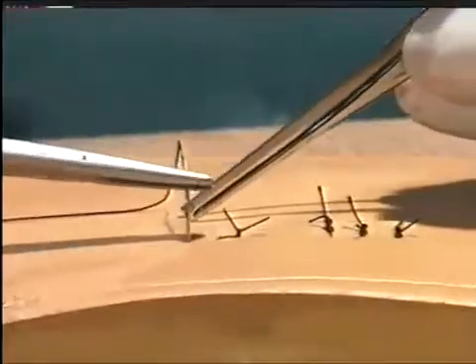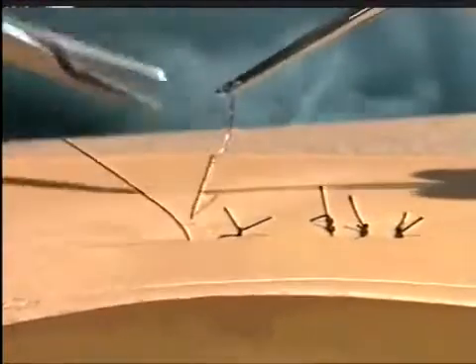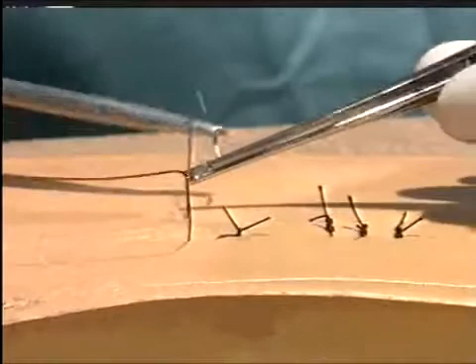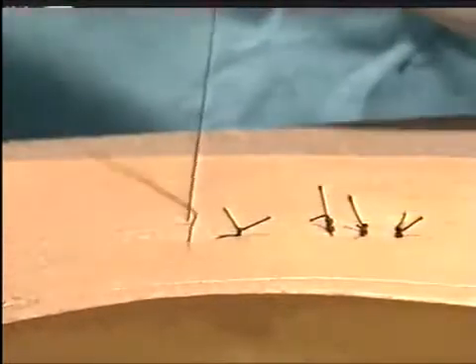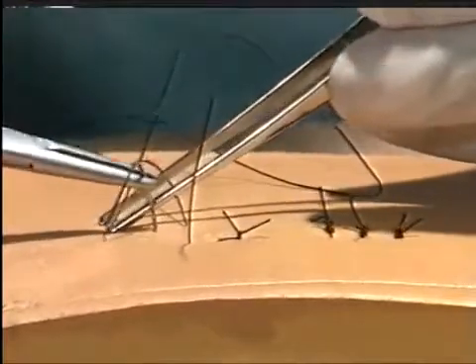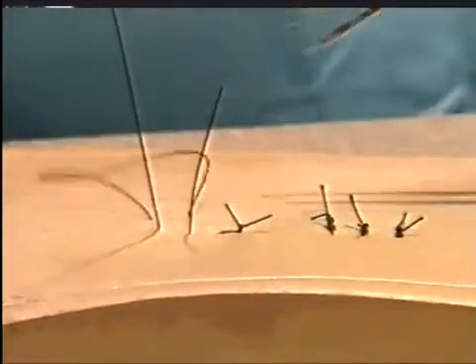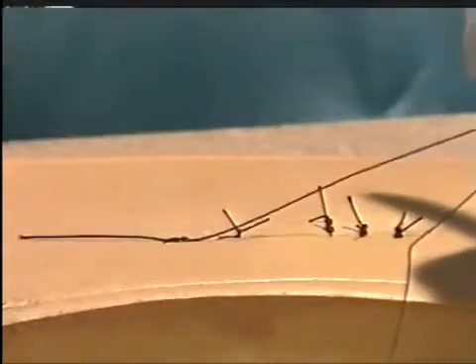We will now insert another horizontal mattress suture. The suture is inserted in the standard manner. The needle reversed and then returned to the opposite side of the wound parallel to the initial traverse. The suture is then secured with a reef knot.